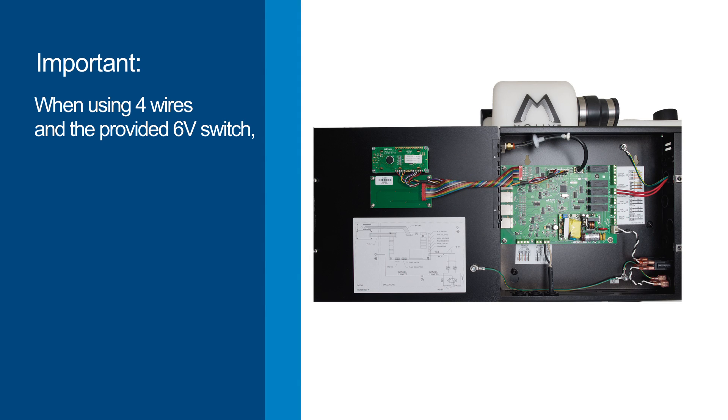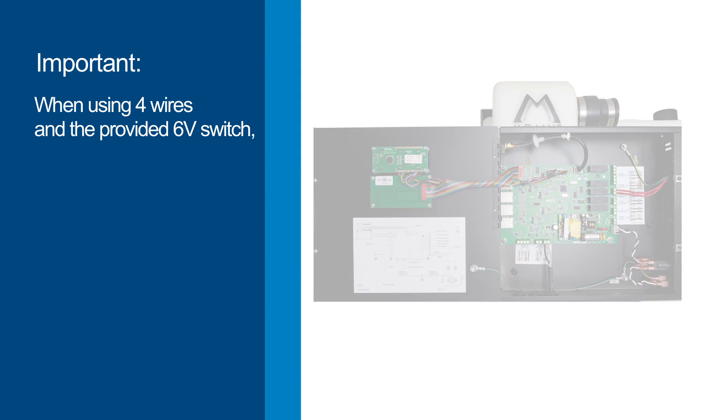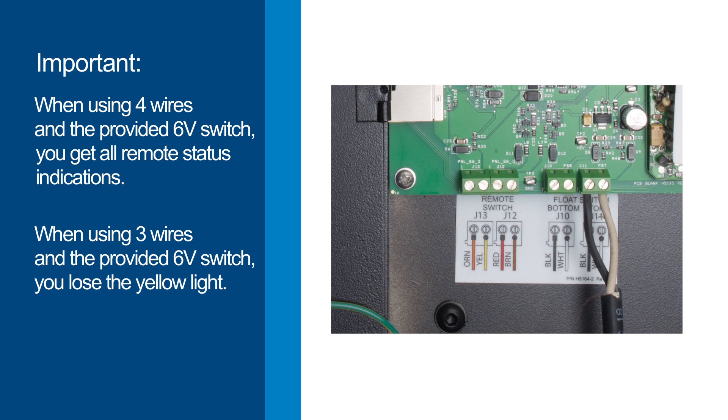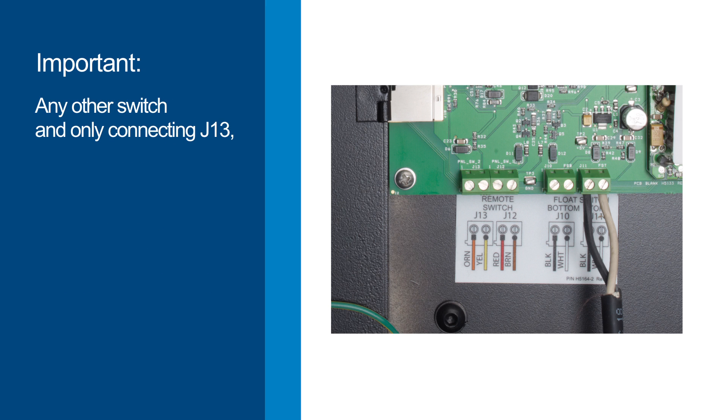When using 4 wires in the ATI-provided 6-volt switch, you get all remote status indications. When using 3 wires in the ATI-provided 6-volt switch, you'll lose the yellow light used for code indications. Using any other switch and only connecting J13, note that no lights will work.